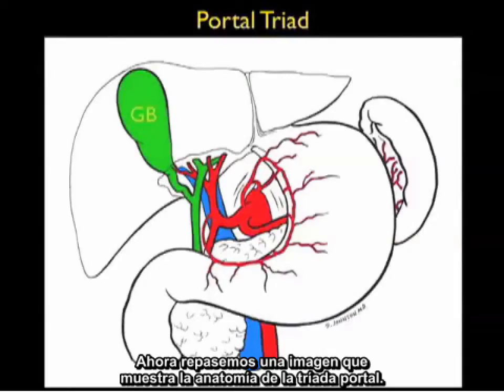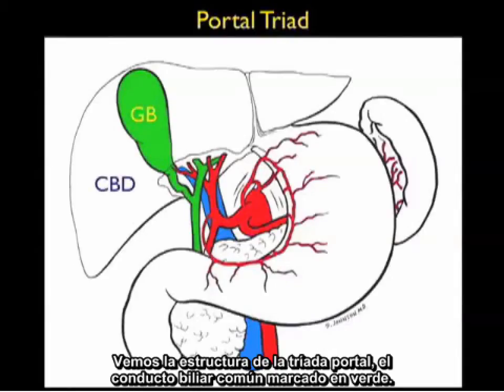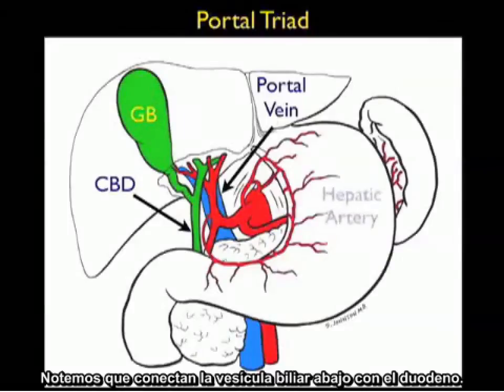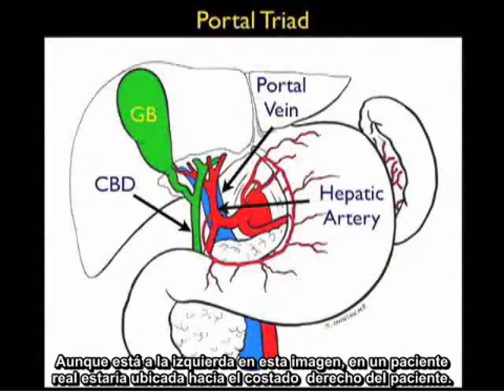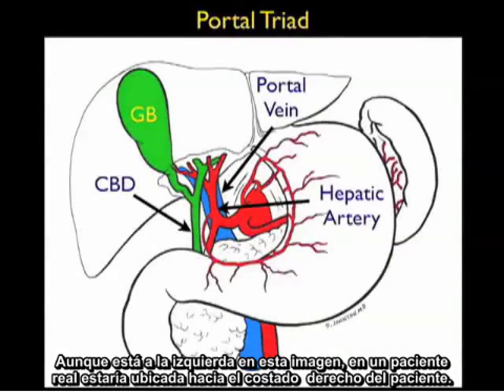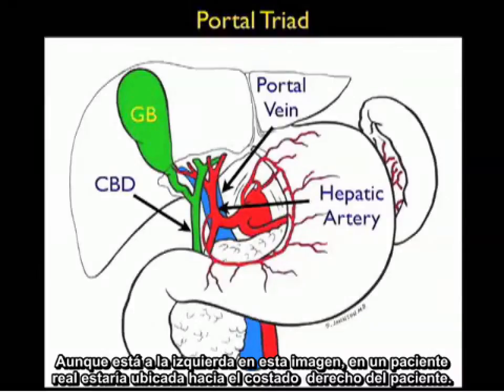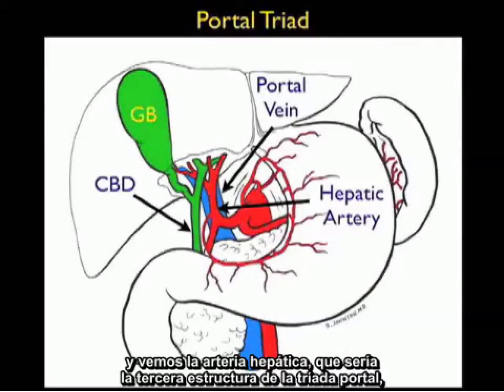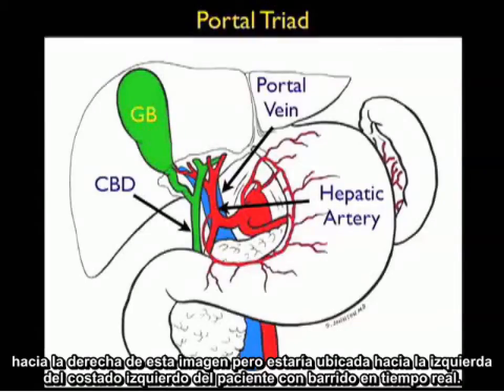Now let's review an image showing the anatomy of the portal triad. The first structure is the common bile duct, marked in green, which connects the gallbladder down to the duodenum. The posterior structure is the portal vein, marked in blue. The third structure is the hepatic artery. In a real patient, the common bile duct is located towards the patient's right side and the hepatic artery towards the patient's left side on real-time scanning.